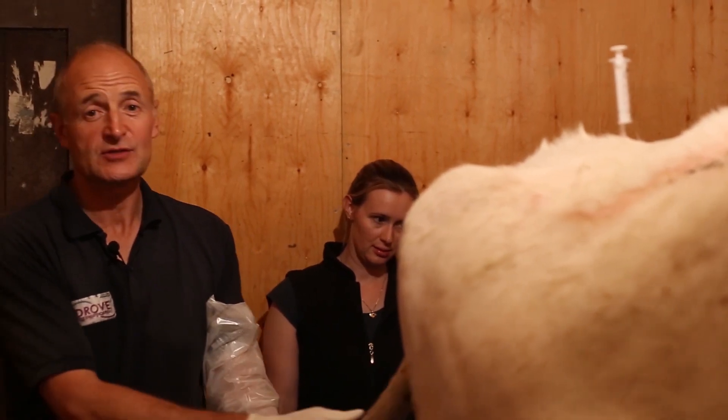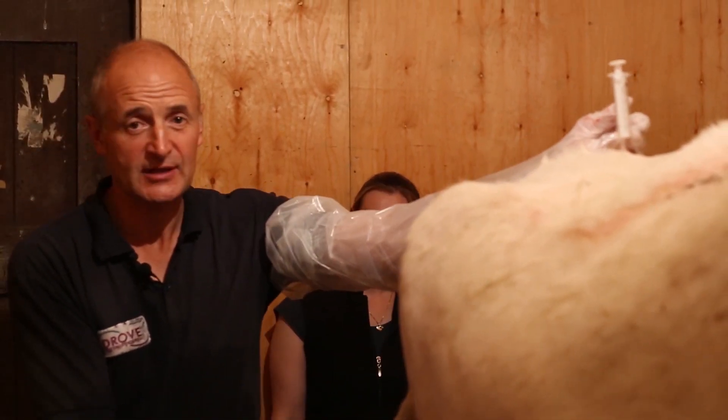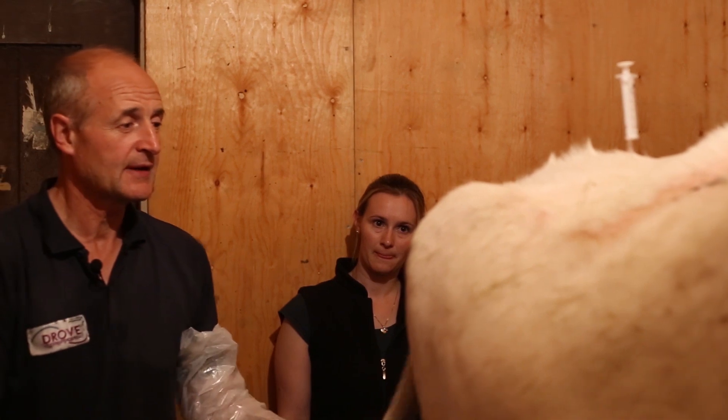Here's Monica. She's about to undergo some ovum pick-up. First of all, we've given her a caudal epidural anaesthetic to anaesthetise her properly. Seems to have taken. I've also given her a small dose of ACP in the tail vein. So now we're ready to proceed.